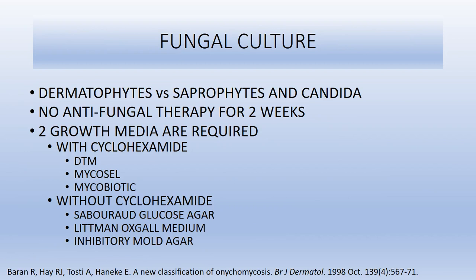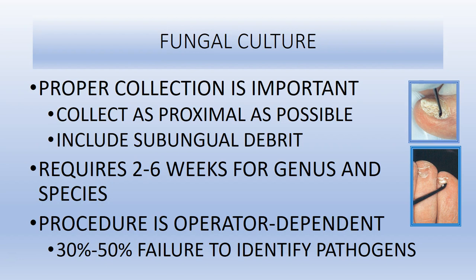Fungal cultures remain very, very popular. 2 fungal media are generally required, and it's recommended that no antifungal therapy be utilized for 2 weeks prior to obtaining the culture. I think one of the real downsides of fungal cultures is that proper collection technique is important. I think all too frequently a piece of the nail is just clipped and sent off to the laboratory, and we're really not getting representative samples in general for the fungi presenting. You want to collect the samples as proximally as you can get and get some fungal debris present.